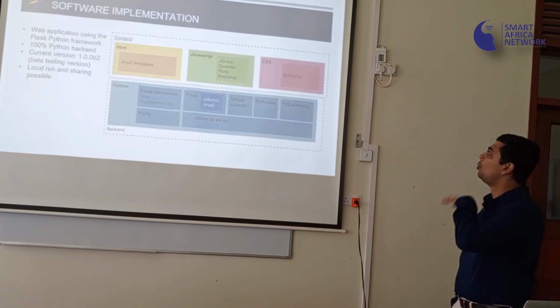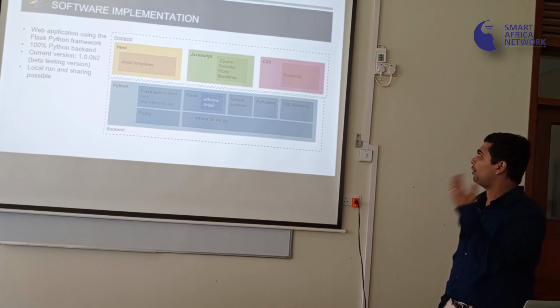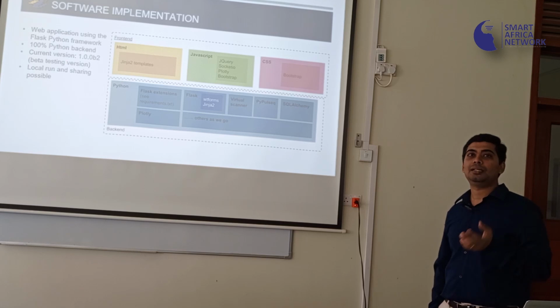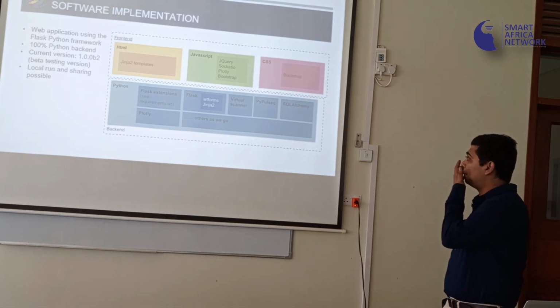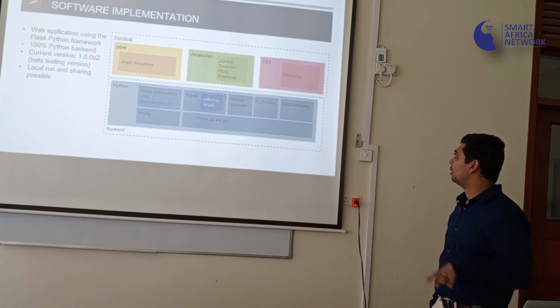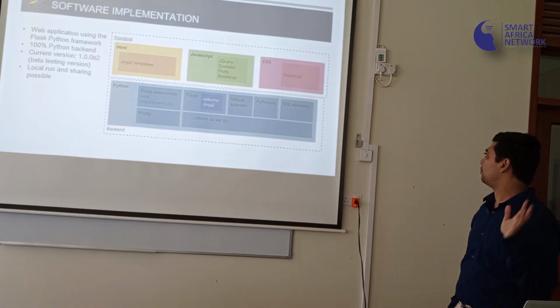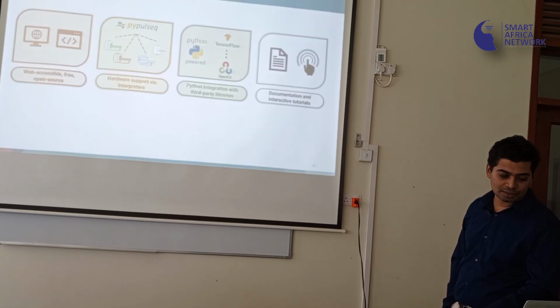This is about how this whole thing has been implemented in terms of the front end that you see, and the user interfaces are quite intuitive and interactive. And then at the back end, you have Python working constantly with Flask, WTForms and Jinja. So I think, yeah, it's taken quite a while.